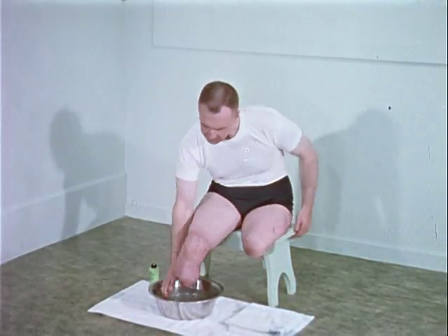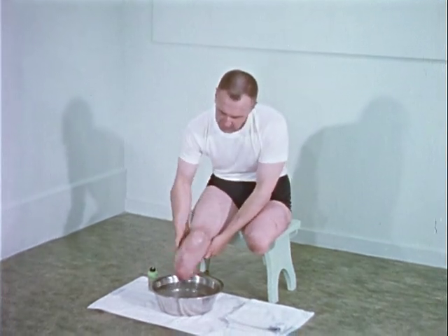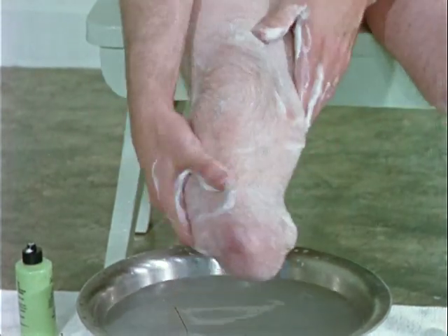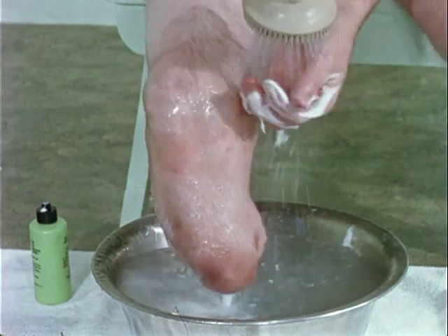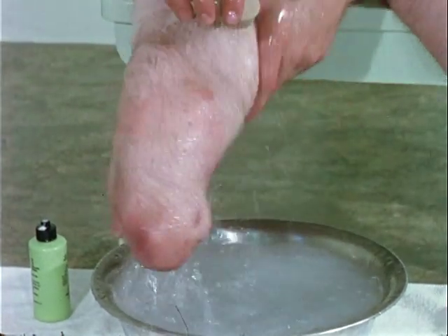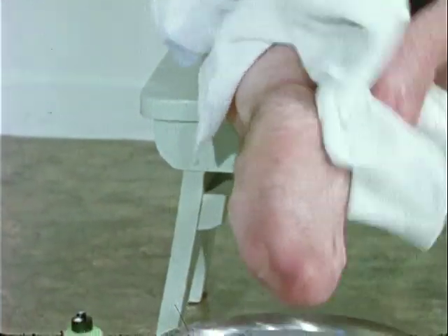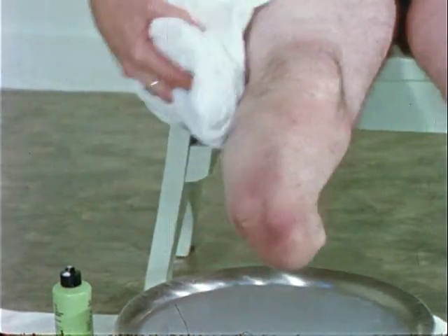Good care of the stump skin is a vital part of rehabilitation and can prevent many complications which might delay continued use of the prosthesis by the patient. A daily routine of stump cleansing with a good white soap is important. The stump should be thoroughly rinsed, and proper drying will prevent irritation and maceration of the skin. Stump cleansing at night rather than in the morning will eliminate the possibility of damp skin sticking to the prosthesis, which tends to cause skin irritation.